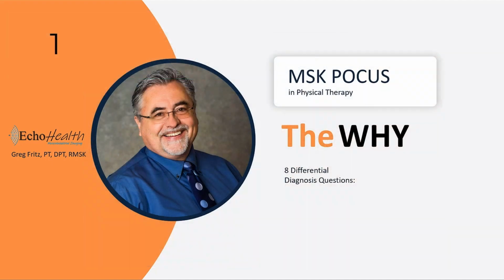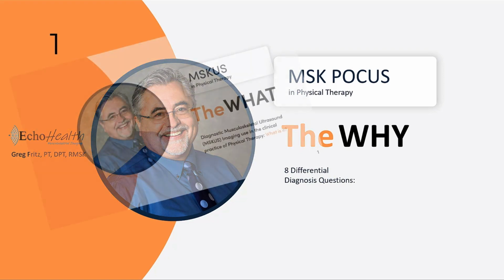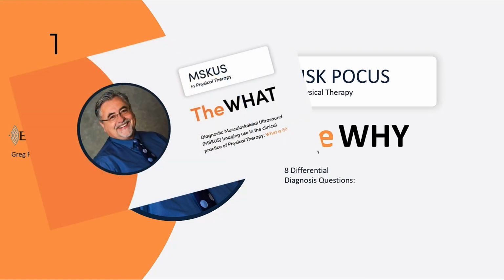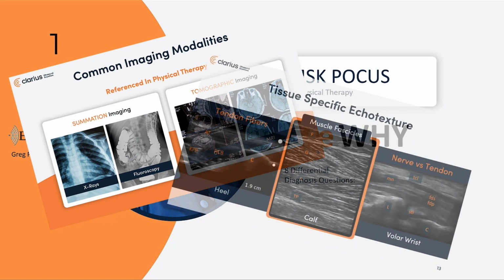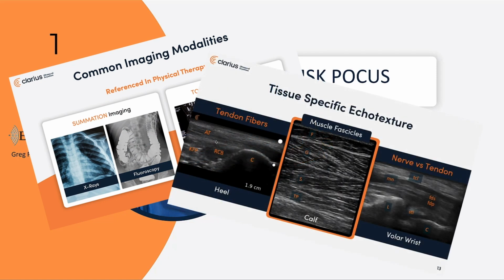And this is a second video in a 3-part series that I'm hoping to educate my own occupation group to the use of diagnostic ultrasound imaging in our practice. The first video is entitled The What? I encourage you to take a look at it. It does briefly outline how ultrasound fits into the imaging modalities in our practice, and it also gives you some identification of what structures look like in the body under an ultrasound view.